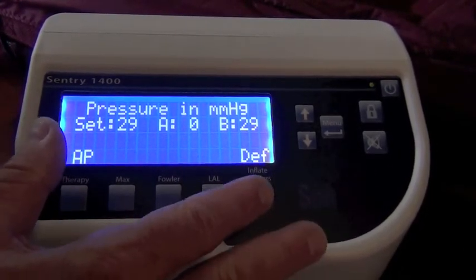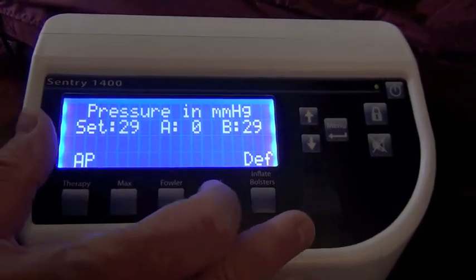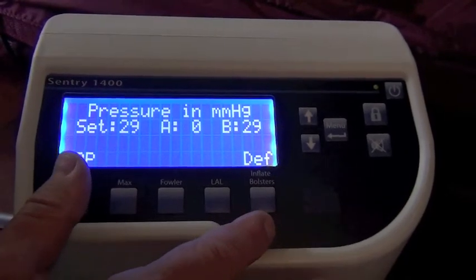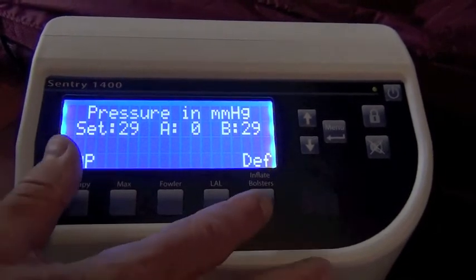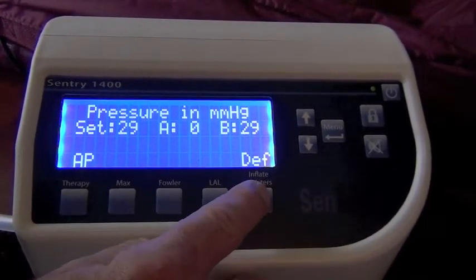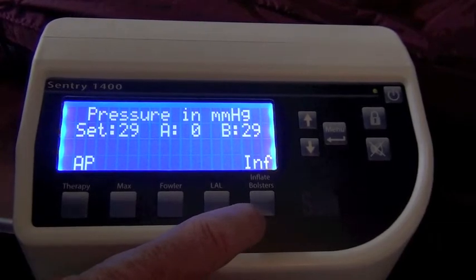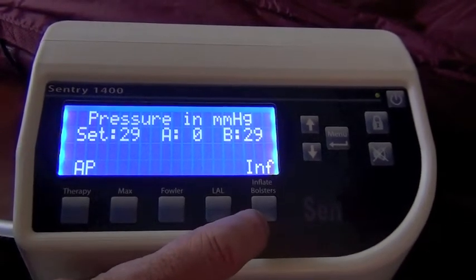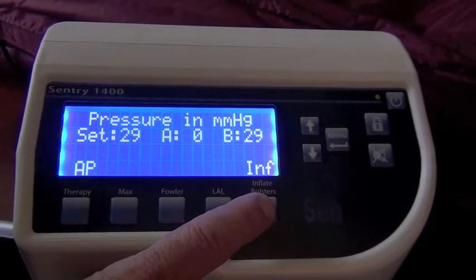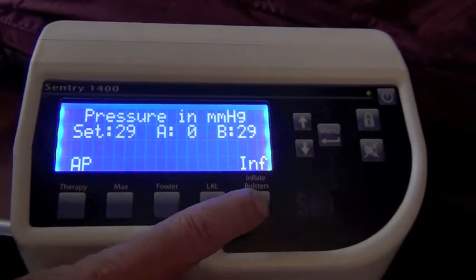However, on top of those integrated side bolsters, which run head to foot, are safety bolsters, and there are two on each side that rest on top of the side bolsters. These can be inflated or deflated, again at your discretion, and they're primarily there to serve as a reminder to patients that they're approaching the periphery of the bed. And in most situations they remain inflated.